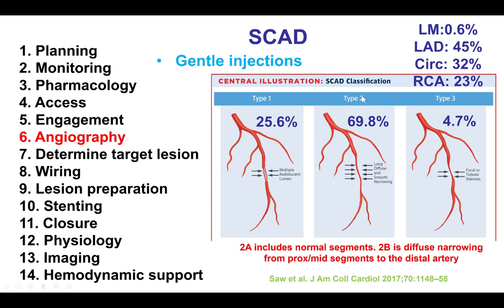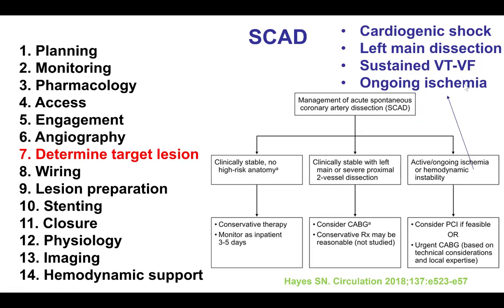This is a type 2 SCAD with a long diffuse and smooth narrowing. This is actually a type 2B, as the narrowing goes all the way from the beginning of the PDA to the distal portion of the artery. Interestingly, the right coronary artery is the least likely to cause a spontaneous coronary artery dissection, but this was the culprit in our patient.